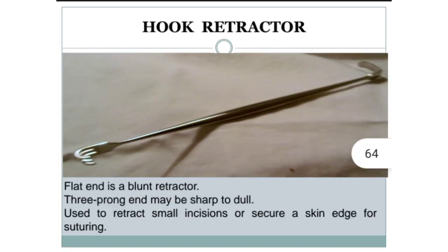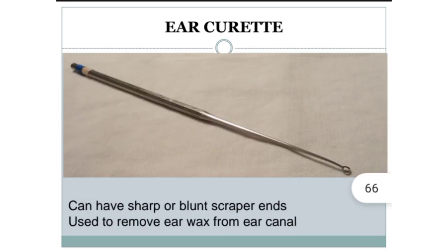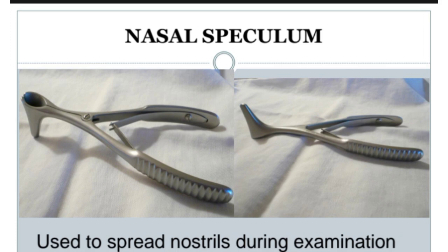This is a hook retractor. They have a flat end at one side, and the flat end is blunt, is a blunt retractor. They also have a three prong end that may be sharp or dull. So they are used to retract small incision or secure a skin edge for suturing. Okay, so guys, this is an ear curette. It can have a sharp or blunt scraper end used to remove earwax from the ear canal.